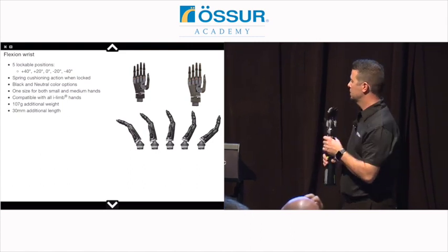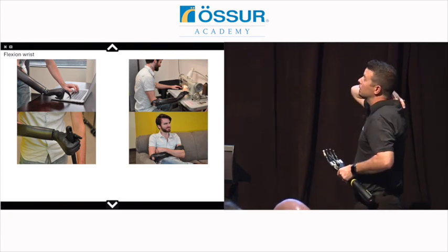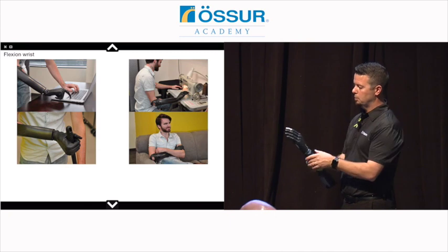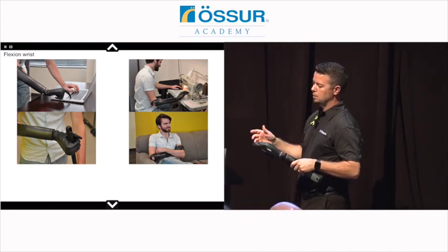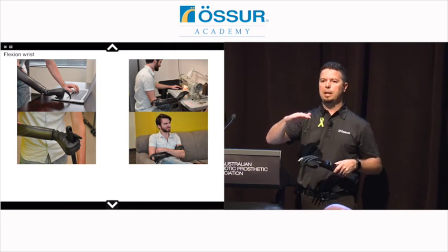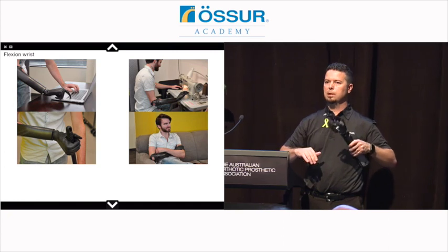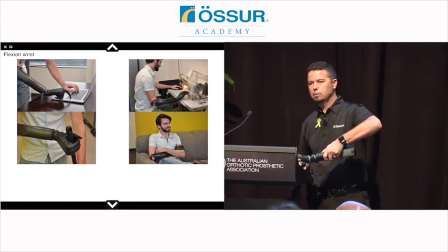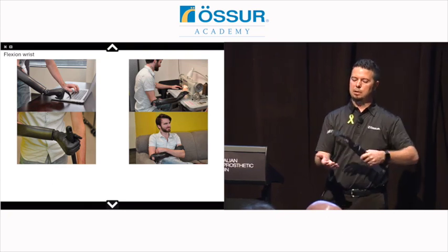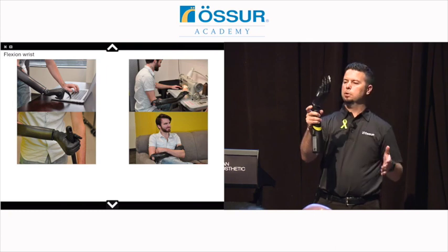We've got some pictures here on this next page. It does add some length and weight. Another reason that people really seem to like it is something, and this seems so simple, but I've heard this over and over, is just something like signing your name, or you're at a different table height, maybe at a bank, or you're working at a kitchen table, cutting vegetables or something like that. Just being able to push and have the wrist conform to whatever you're holding or supporting is a big deal. But then there is also a sliding mechanism that allows you to lock it in different positions as well.